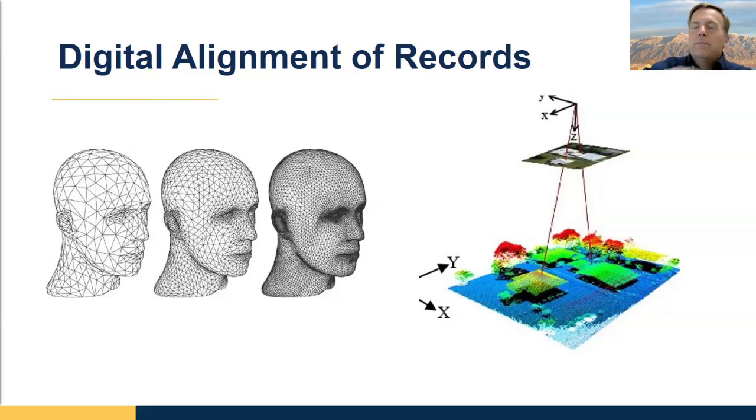In the digital world, we need to make sure that we get good files, and that the alignment of the files is the same as in the mouth. The most obvious example of this, and the one that I'll use, is taking a bite scan. Let's say you're doing an immediate denture, you scan the upper arch, and what the software creates is a point cloud, and the little points are grouped into triangles. Every point of every triangle is defined as a certain XYZ distance from one imaginary point that's called the origin point. So you scan the upper, you create a file with an origin point.